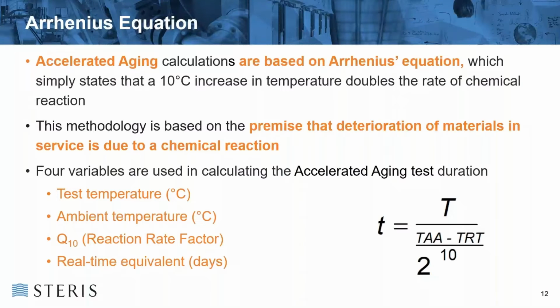The Q10 value, or the reaction rate factor, is normally for medical devices set to 2. We'll have a look at that shortly as well. The fourth is the actual duration in days, the real-time days that you want the package to last for.